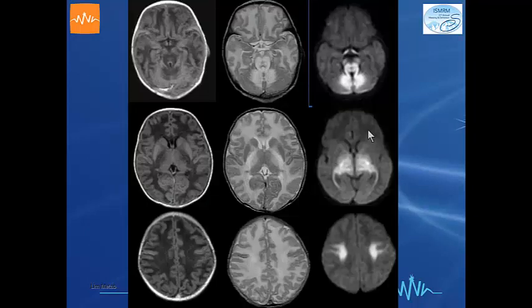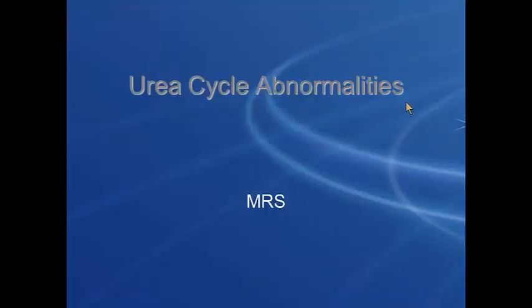And this is very typical in a patient who is a neonate who has not had a lot of myelinated white matter, but what is myelinated is completely abnormal. So those early myelinating white matter tracts in the corticospinal tracts, in the white matter that is already myelinated at birth, are badly affected, with restricted diffusion and high signal intensity on DWI, and you can appreciate that on the T1 and T2 there's not a whole lot of contrast between the badly affected tissue and those that are not.